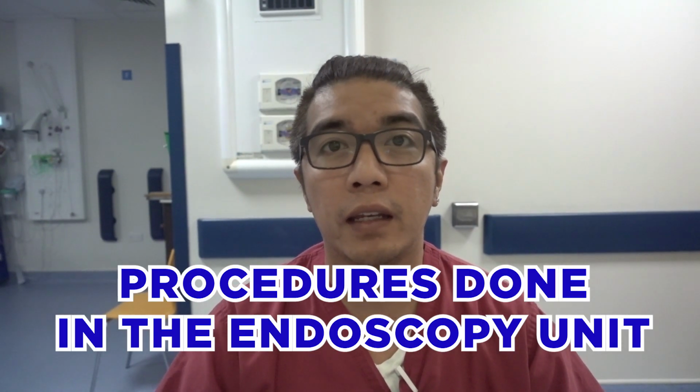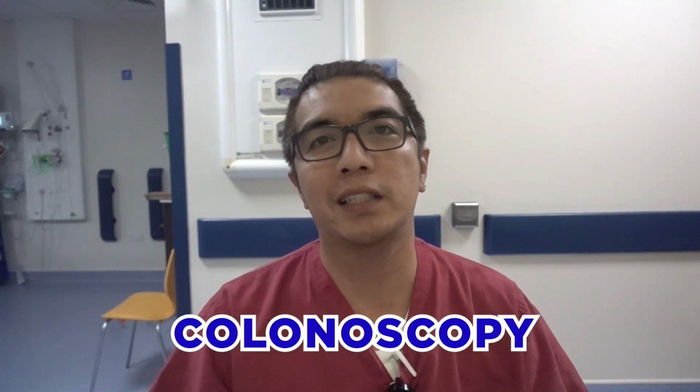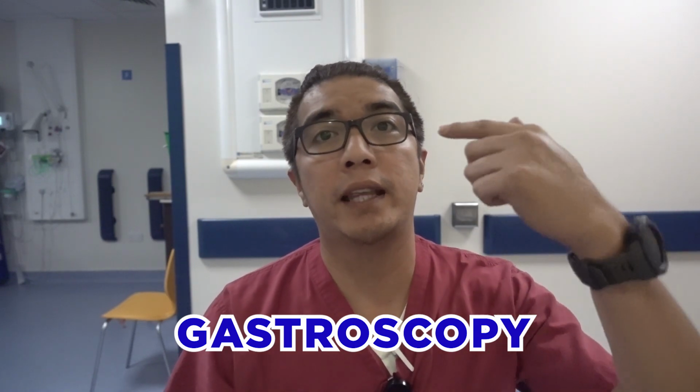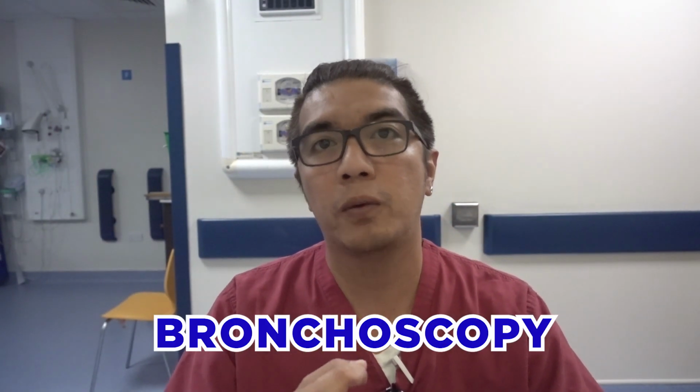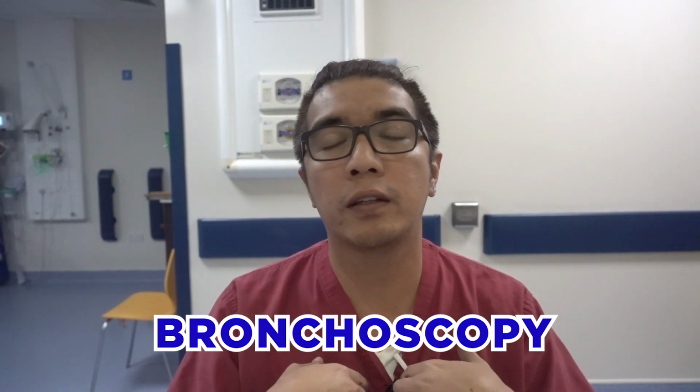So first things first, what types of procedure do we do in an endoscopy unit? We're just gonna briefly touch on those procedures, and we'll have a different video which is gonna discuss endoscopic procedures in detail. The types of procedure that we do here are colonoscopy, which is a camera test up your bottom passage; gastroscopy, which is a camera test down the throat; bronchoscopy, which is a camera that goes down to your lungs, to your tracheobronchial tree.